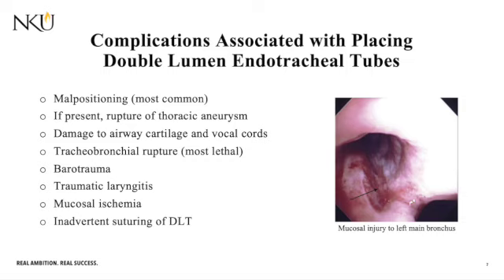Let's review how to use this bronchoscope. A simple downward motion will pull the tip of the scope up, and an upward motion will pull the tip of the scope down. You're able to turn this bronchoscope by simply twisting your wrist. Now let's review the left double lumen endotracheal tube. As you can see, it says left on the side of it. There are two lumens. The first is a bronchial lumen that holds 3 cc's of air. The next is a tracheal lumen that holds 10 cc's of air.